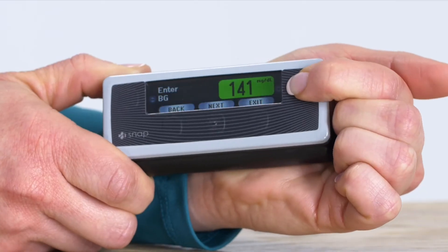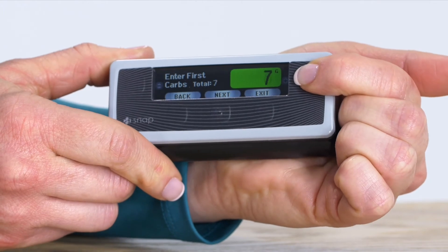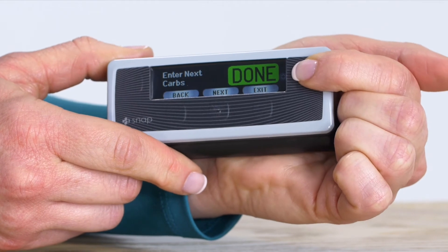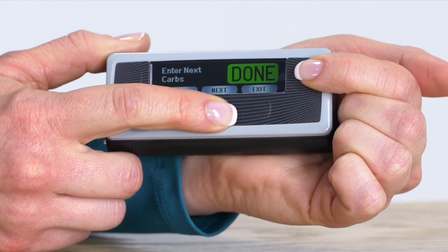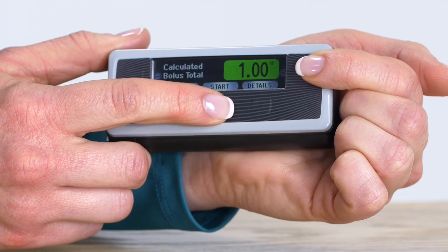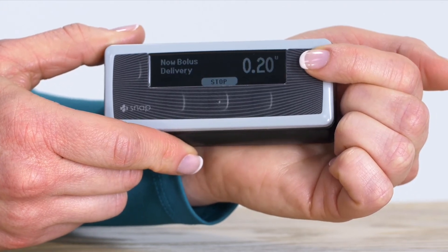One of the most common things you will do every day with your pump is deliver a bolus. Say for example, I'm going to have a yogurt and an apple. I've checked my blood sugar and I start entering it here. Next, I'm going to enter the carbs for my yogurt. If I also want to enter the carbs for my apple, I can add it here and the pump will calculate the total. The pump will show me my recommended delivery dose. I simply press start and the bolus will go. What we just did there is called a smart bolus.